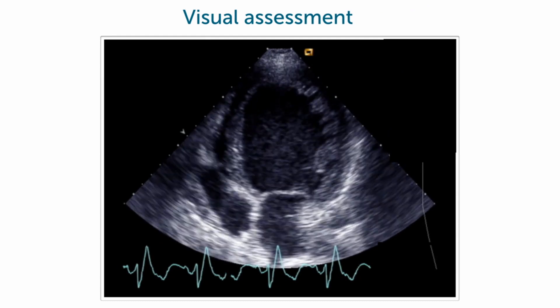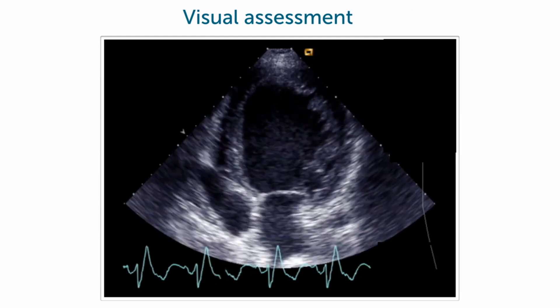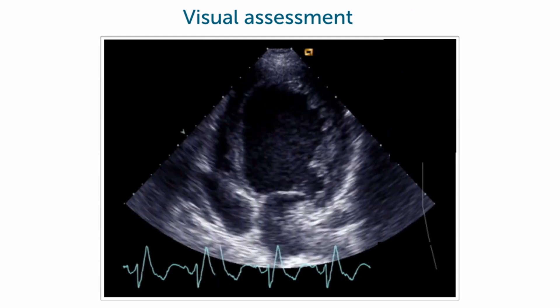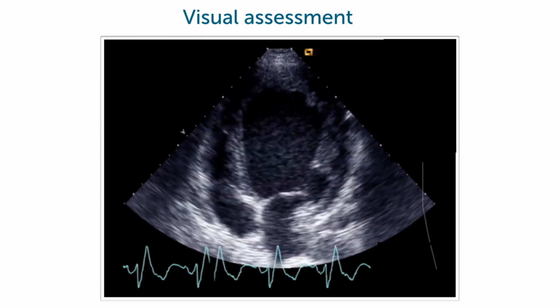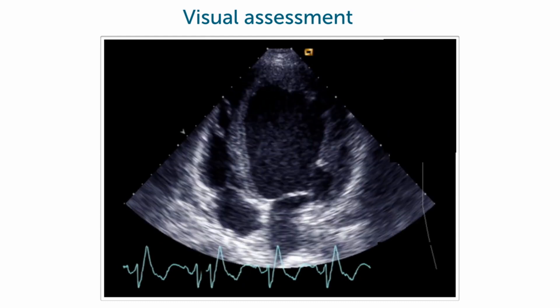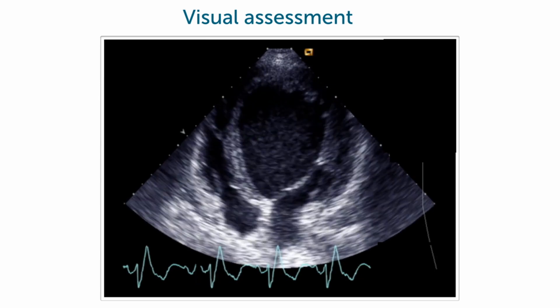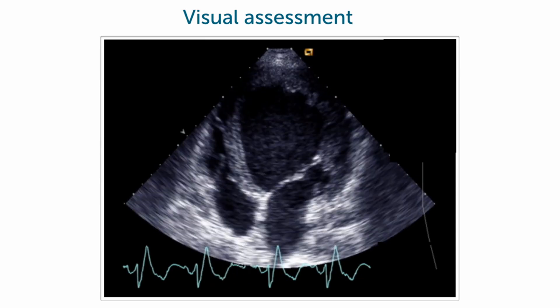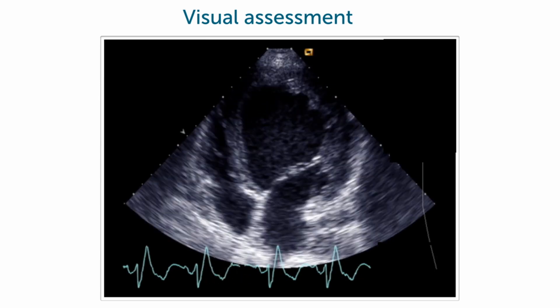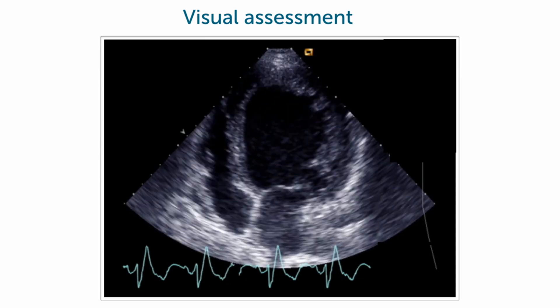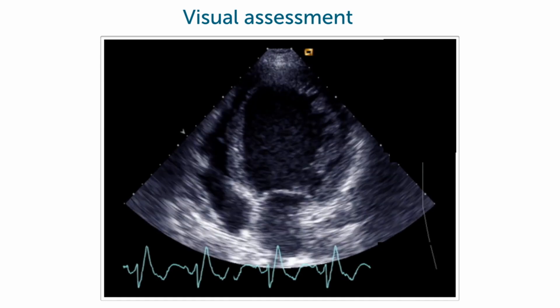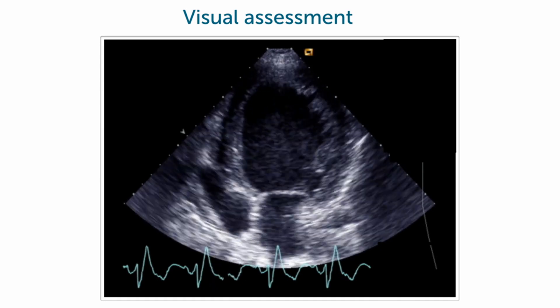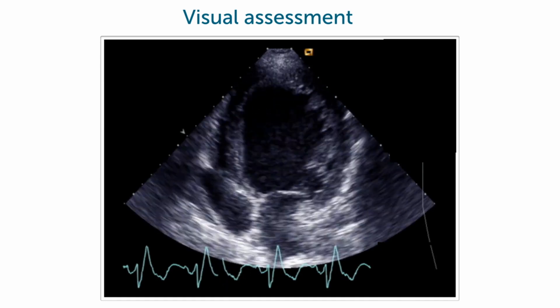You can see a rocking motion of the apex, and a hula hoop motion if you compare the lateral wall with the septal wall. I'm sure most of you will appreciate that dyssynchrony is present.